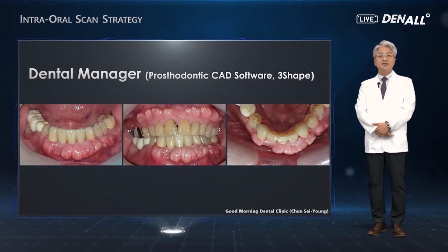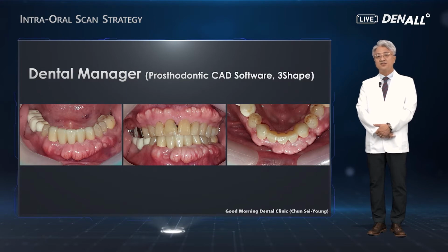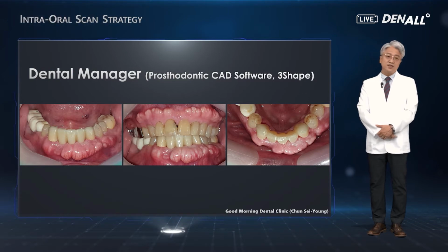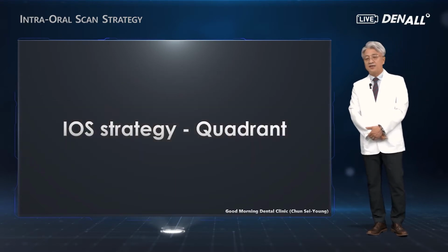Using the model-less approach in our office, designing is done, milling and sintering processes have been conducted, and the prosthesis is delivered to the patient. I cannot say it's a superb prosthesis, but based on my clinical experience, it doesn't have discomfort, and actually it was pretty satisfactory for me and for my patient. The prosthesis was fabricated very easily for the clinical treatment.